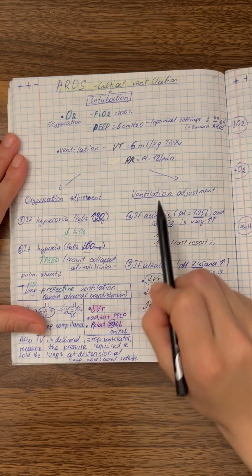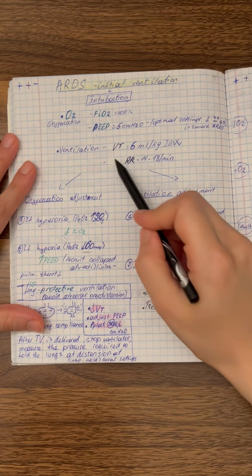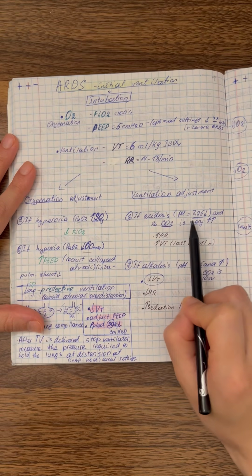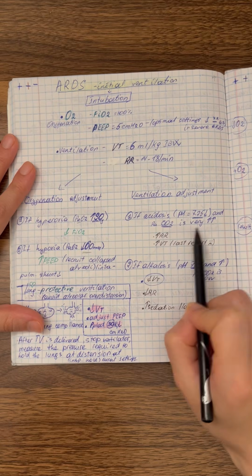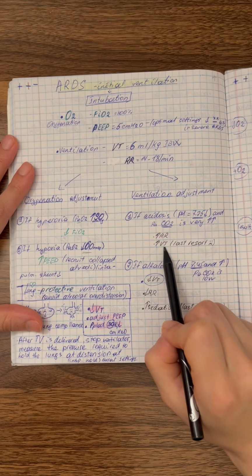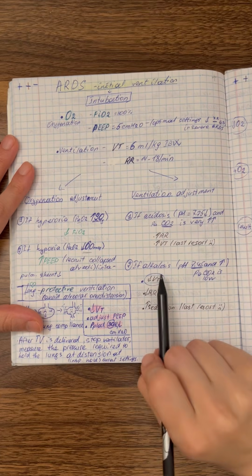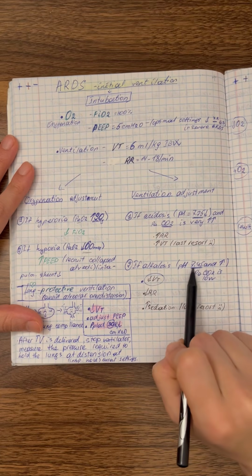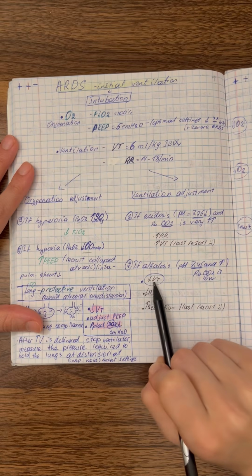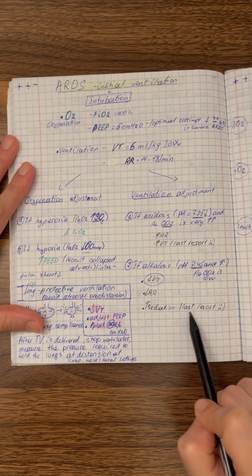If we need to adjust the ventilation, we can change respiratory rate or tidal volume. If the patient has acidosis, pH is less than 7.25 and PaCO2 is very high, we will increase respiratory rate, and at last resort we will increase tidal volume. One more time, firstly we are increasing respiratory rate. And when the patient has alkalosis, pH is 7.45 and more, and PaCO2 is low, we will decrease tidal volume, we can decrease the respiratory rate, and at last resort, we will increase the sedation.